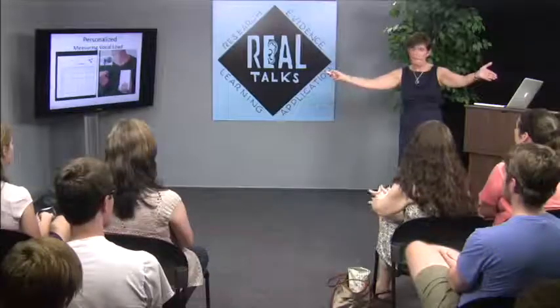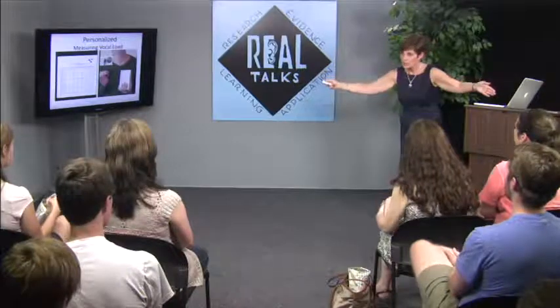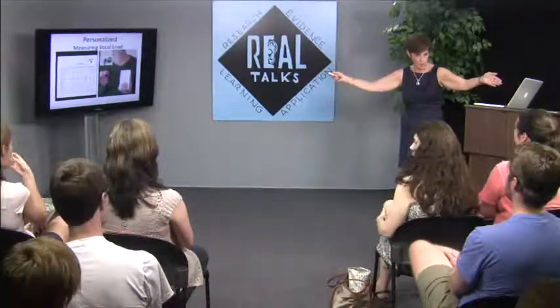So what we have now is vocal dosimetry. It is a computer-based method of tracking how many times your vocal folds vibrate in a given period of time and how far they move with each one of those vibrations. And that measurement can be in miles or kilometers.